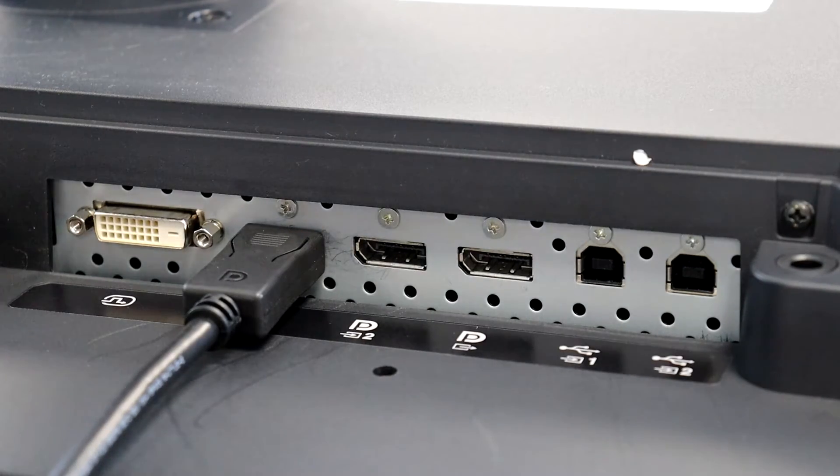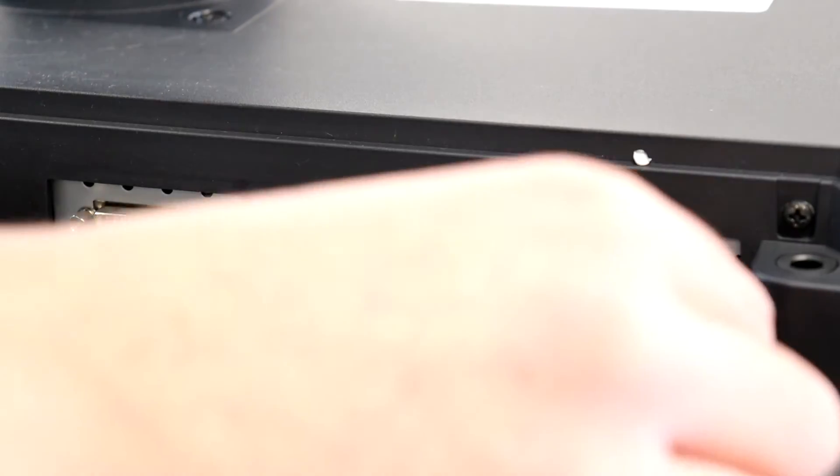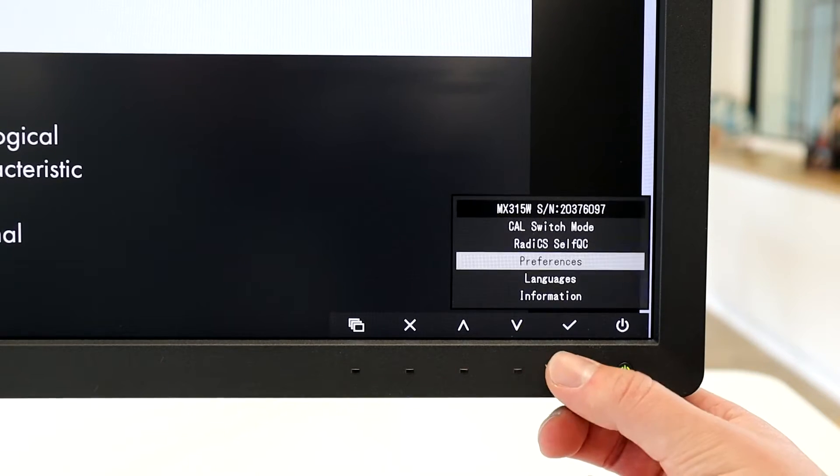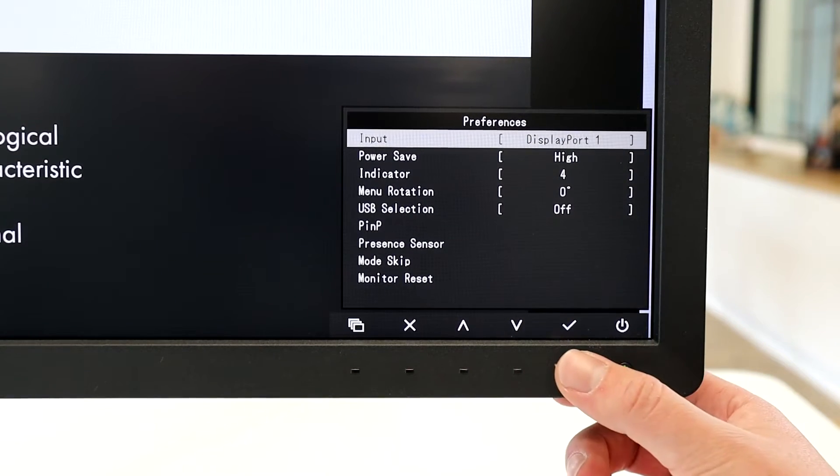If you would like to run your monitor in two halves, then use the mini DisplayPort cable from the DisplayPort 2 input to the DisplayPort output connector. Then go ahead and change the input settings within preferences.